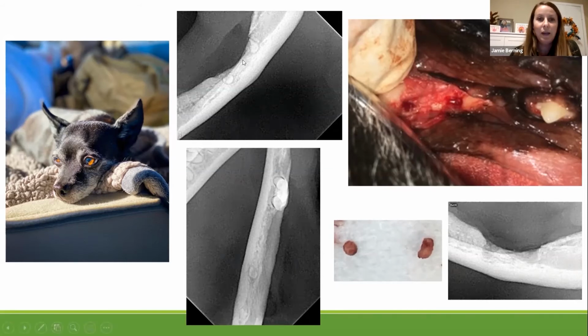But we take this picture and we say, well, okay, here is where our neurovascular bundle should be going, right here. And you can see the reason it was probably bleeding quite significantly is that we actually cut into that and removed plenty of bone in the attempt to get to these roots. Because I didn't have a VetCAT on site, I was in my mobile practice, I was able to take kind of a straight-on DV/VD type of view to see that these tooth roots are indeed closer to the lingual aspect, which I could see here.